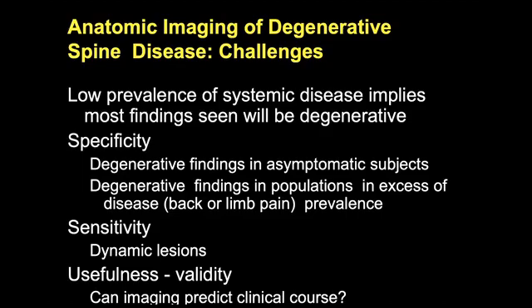There are also sensitivity issues. Remember, sensitivity refers to positive in disease. And so MRI can be insensitive to certain dynamic lesions, such as instability or spondylolisthesis. We'll talk a little bit about that.